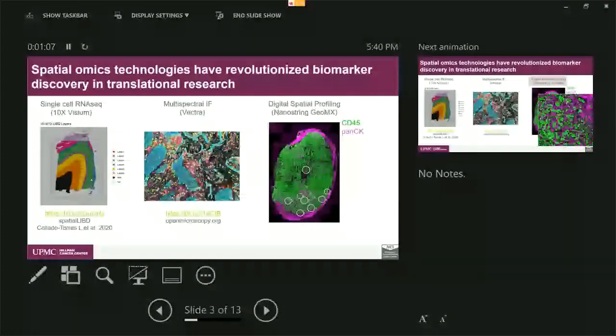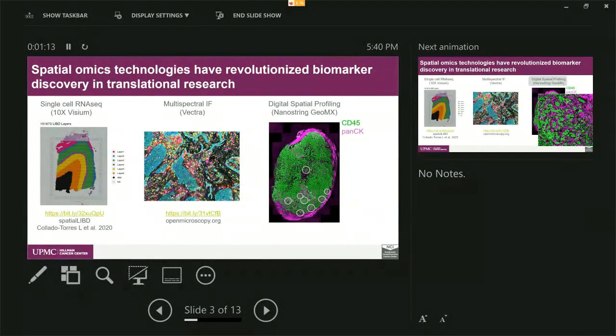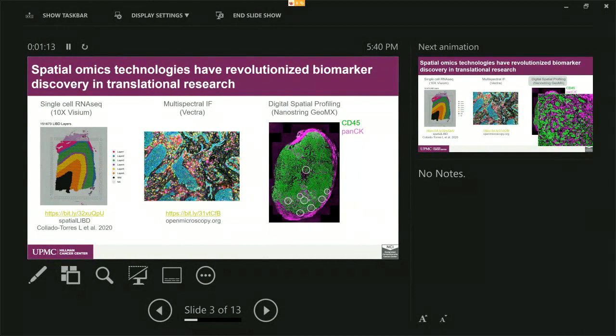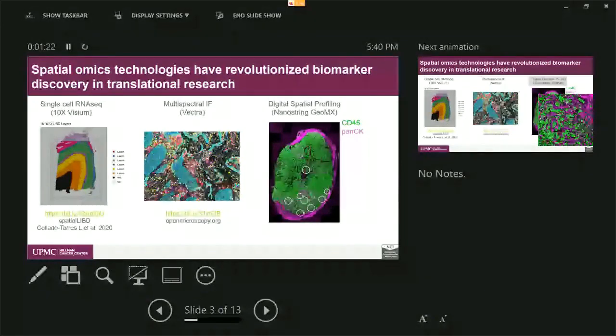For the multiplex immunofluorescence, what you see here is a colorful image where each color represents one cell in one channel. The main purpose of this technology is to profile for each single cell, what's the quantity, relative location, and cell-cell interactions on the same image.